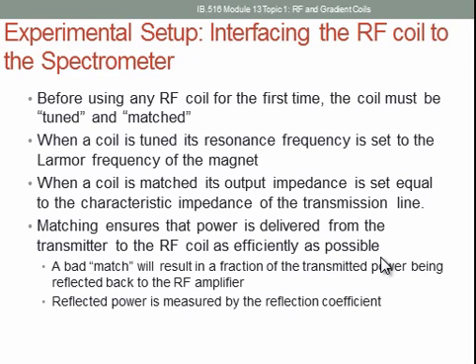Let's say before you actually use a coil for the first time, what you need to do is you need to tune the coil to the resonance frequency. So we talked about that before when we discussed the resonant frequency in an RLC circuit. We also have to match the impedance of the coil to the impedance of the transmission line.